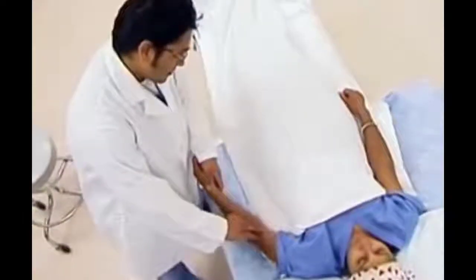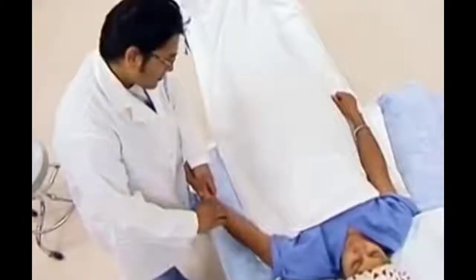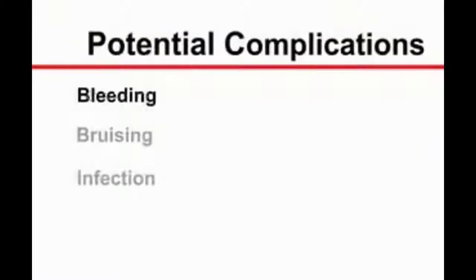Explain the procedure to the patient and address any specific questions or concerns. Discuss potential complications such as bleeding, bruising, and infection.